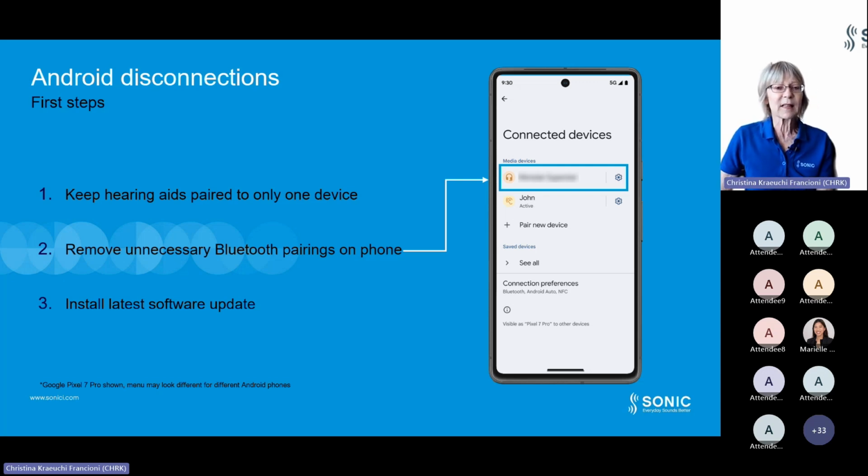It's also very helpful to have the latest software update installed. Connectivity improvements may be provided through software updates. So please make sure that the phone has the latest update. Here are also some steps to check if the latest update has been installed, and this can be found in Settings. In Settings, we will find Software Update. Then we can scroll down to Download and Install and just follow the steps until the new software update has been totally installed.